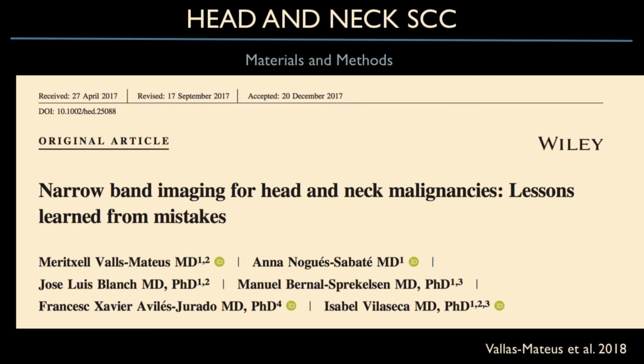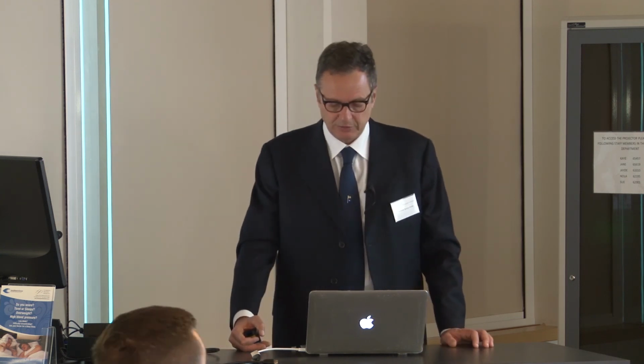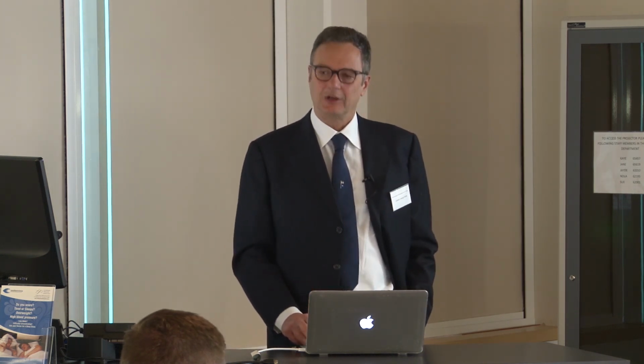Again, the group of Barcelona, Isabel Vilaseca, performed a critical review of those cases that show discrepancy between clinical evaluation and the pathology report. Because NBI combined with the white light endoscopy significantly reduces the false negatives and the false positives in the diagnosis. But there are some scenarios in which NBI is not so useful.